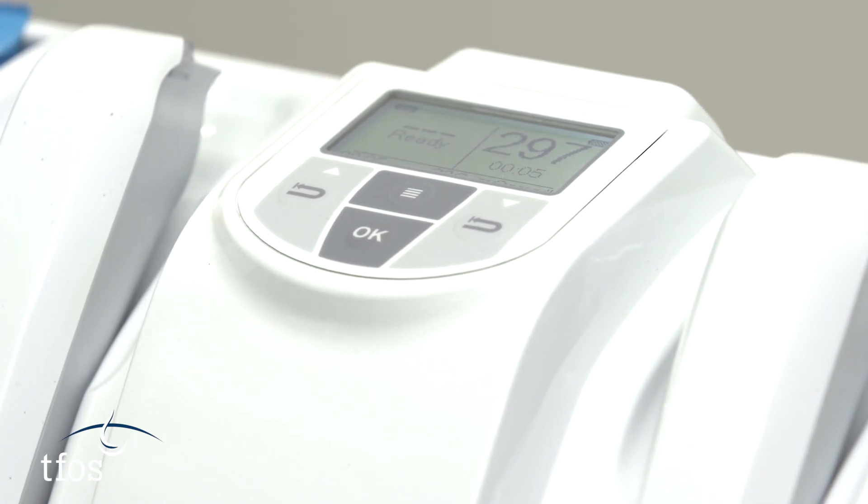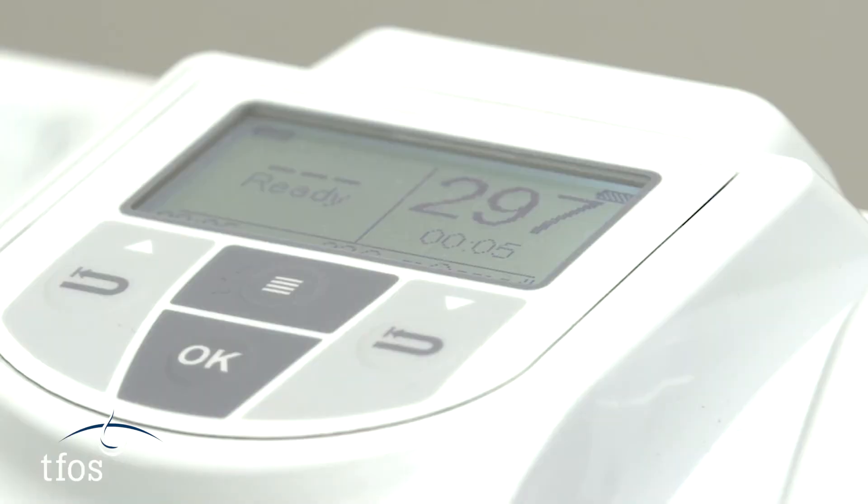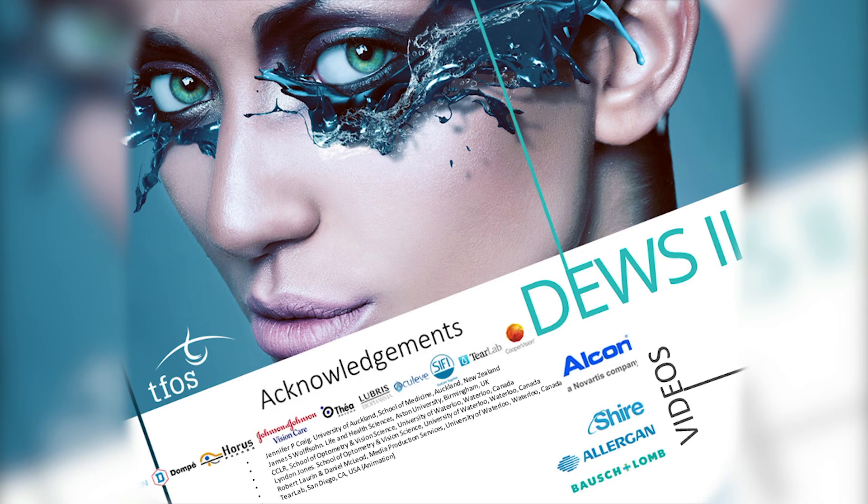In the clinical setting, both eyes are tested in turn and the higher of the two readings is recorded as the osmolarity. Raised tear osmolarity in one or other eye, or a high difference in osmolarity between the two eyes, can be indicative of dry eye disease.